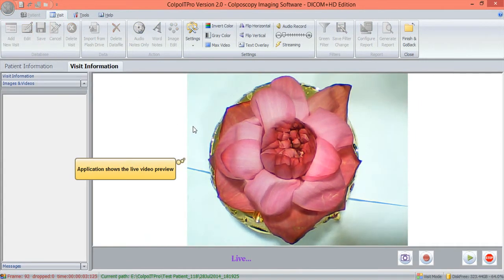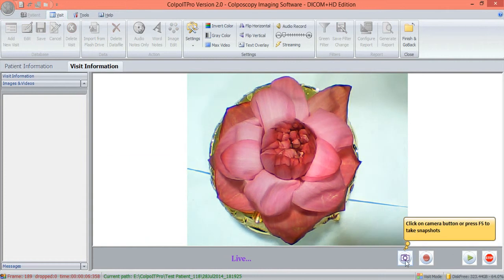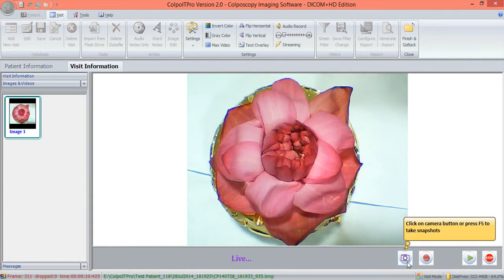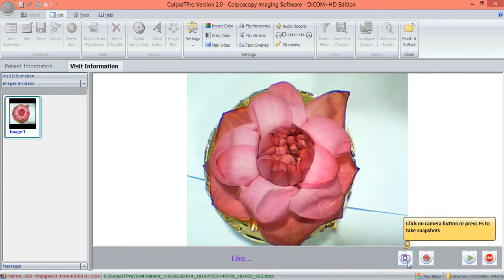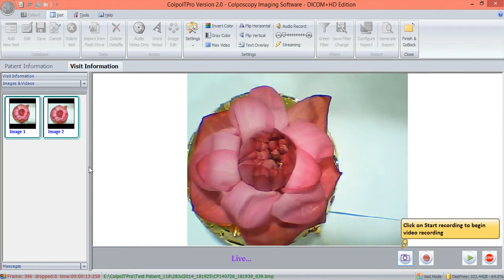The application shows the live video preview. The user can now start capturing images from the live procedure either by clicking on the Camera button or by pressing the F1 key.